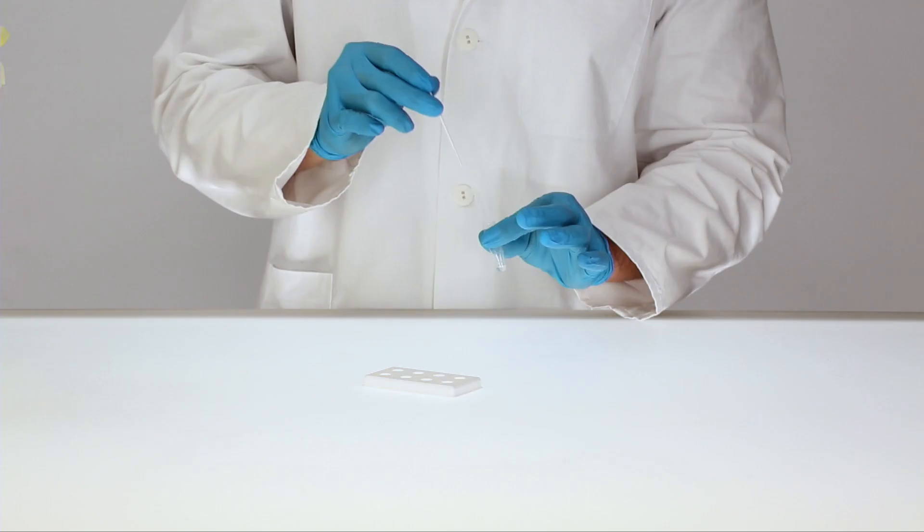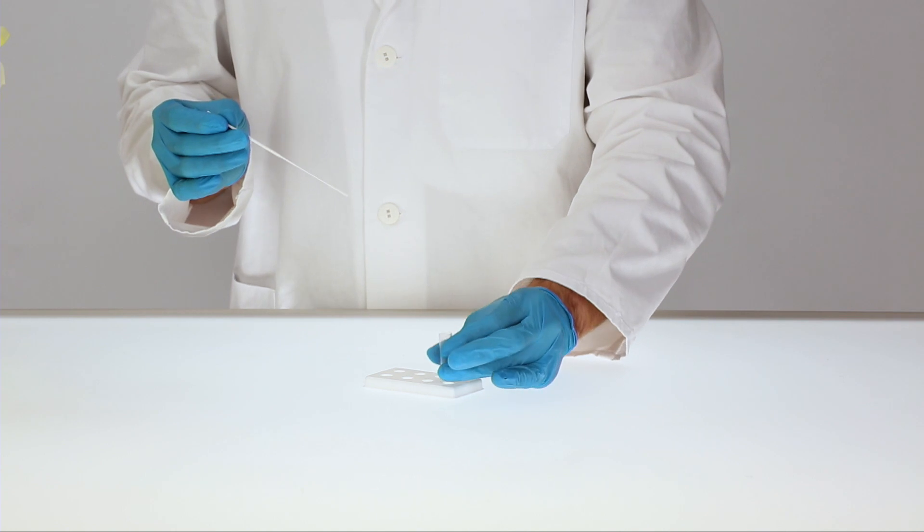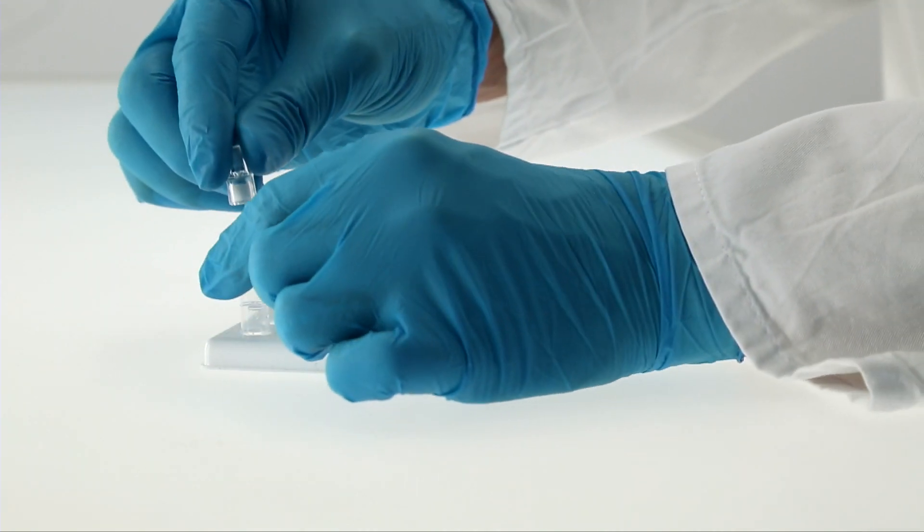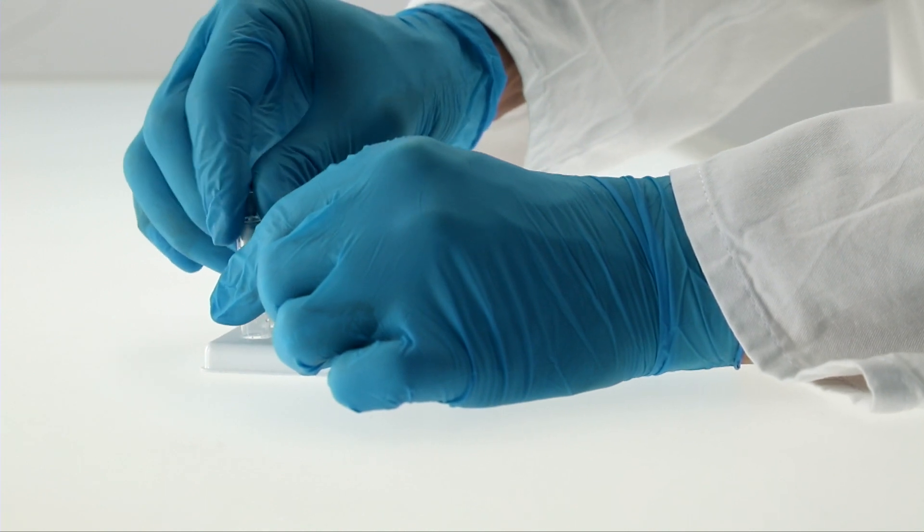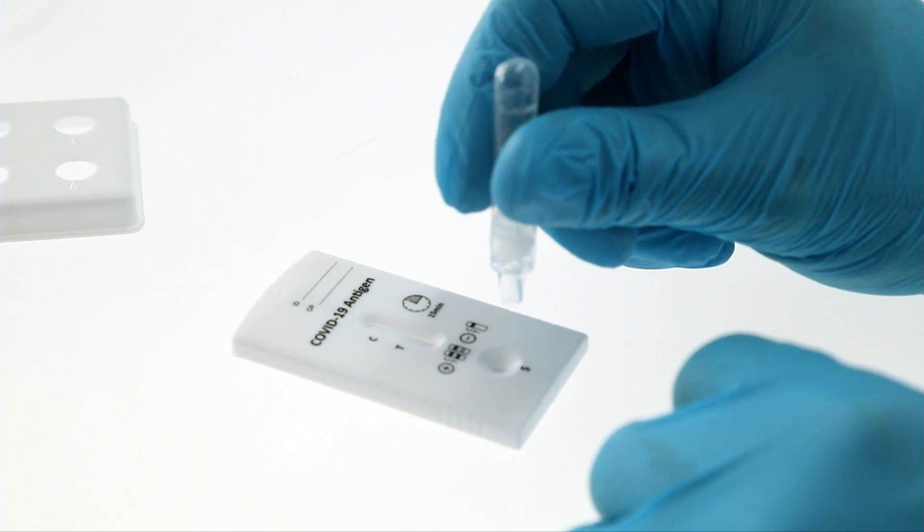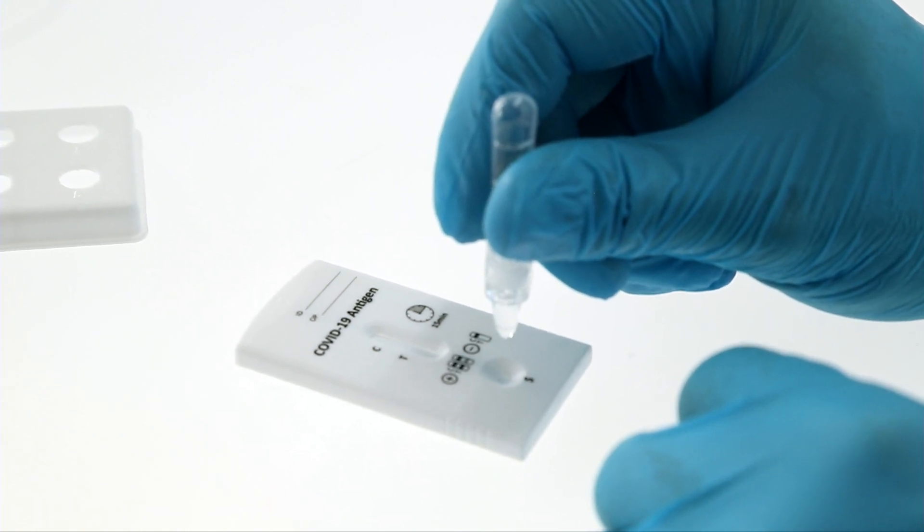When removing the swab, squeeze out as much liquid as possible. Attach a dropper cap to the extraction tube, invert the tube and transfer two drops of the extracted solution to the specimen well of the test cassette.